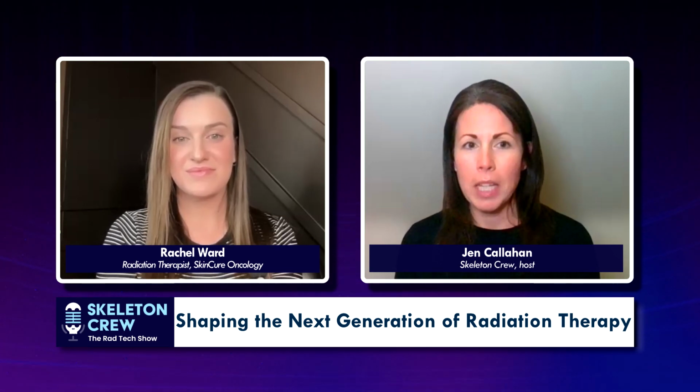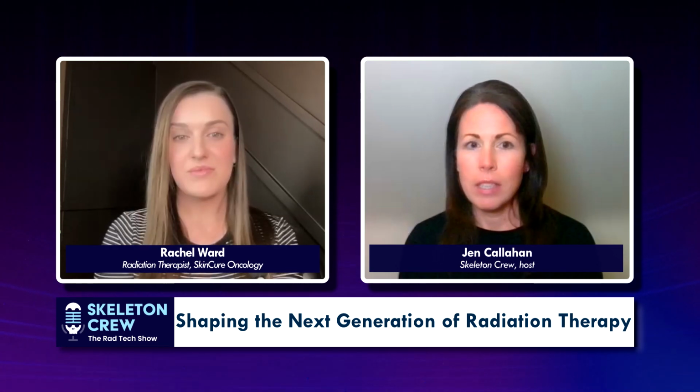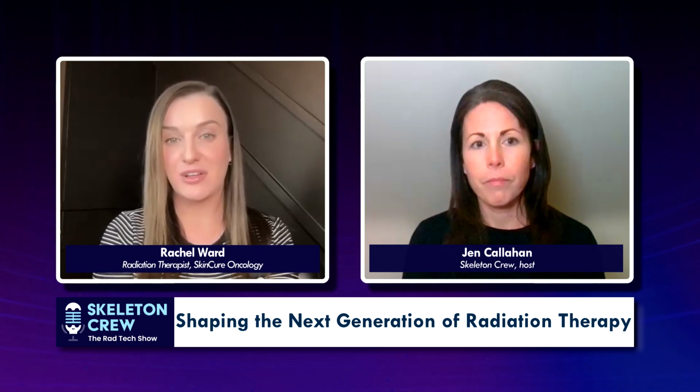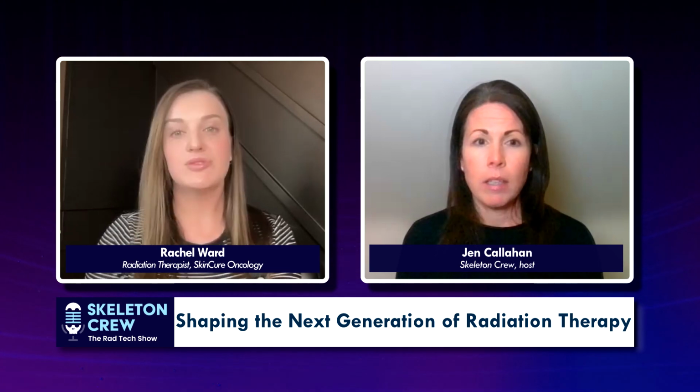So the image guided is really cool. And is this something unique to SkinCure that they've developed? Yes. So right now we're utilizing the Sensus Healthcare's SRT 100 Vision. That one does incorporate that 22 megahertz ultrasound image. Did they use something prior to the Sensus? So SkinCure has been around since about 2015.